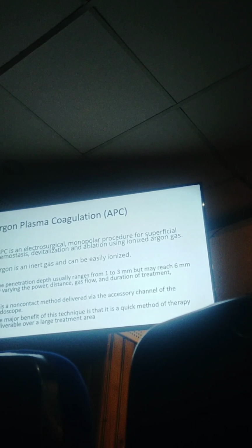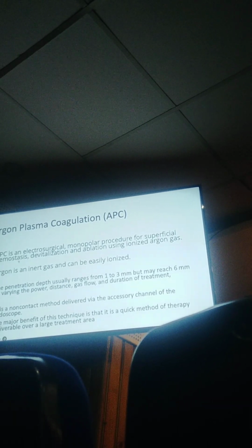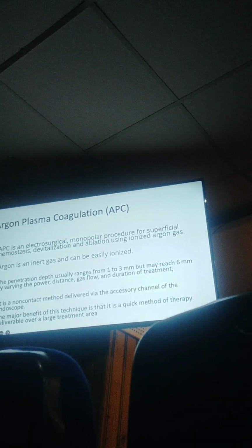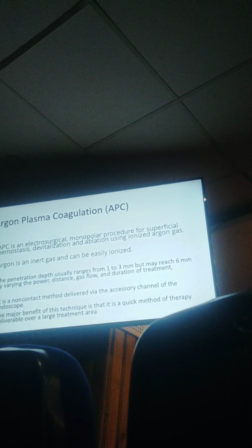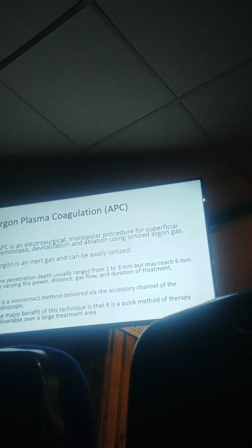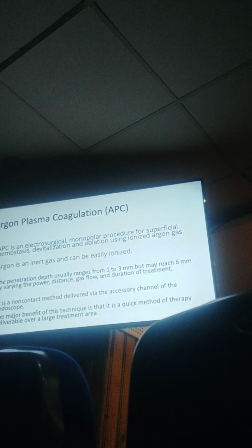When we don't want our electrosurgical effect deep into the tissue, we use APC, for example following liver surgery, or when in the intestine there is a bleeding vessel. Monopolar or bipolar systems might penetrate the tissue. The wall thickness of the intestine would be a few mm. So that may be dangerous. That may lead to perforation.